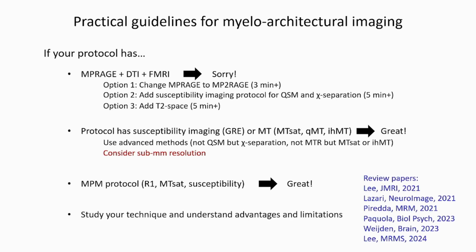Now you have to choose which one to do. My final take-home message is you really need to understand the technology before you use it. There are so many complications here, so there is nothing like a single push-button result that you can call myelin imaging. But again, this is one of the exciting new fields that may give you plenty of new information for the understanding of the brain.